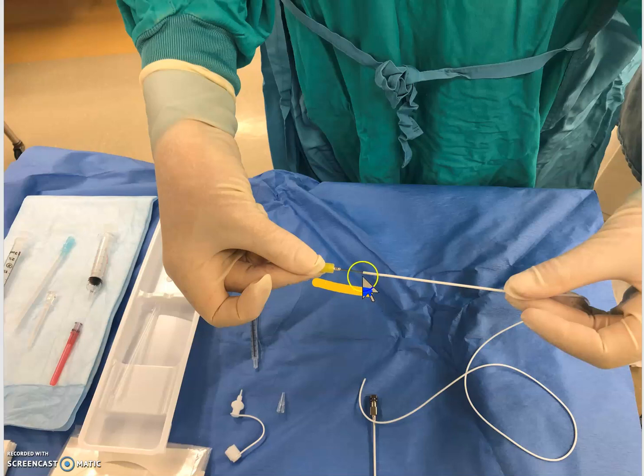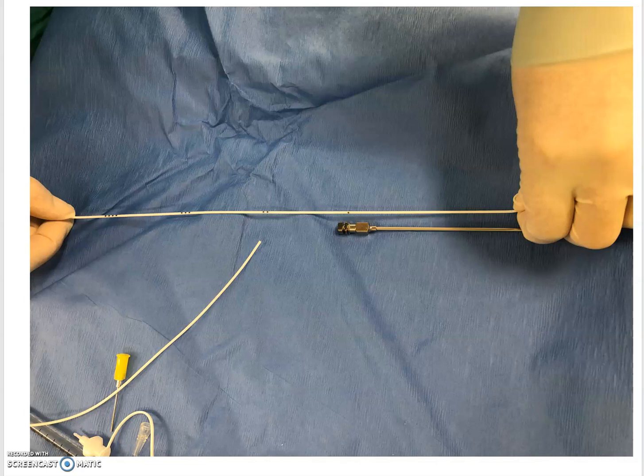The first thing you're going to do is attach that little metal piece to the catheter and flush it with some saline. Then orient yourself to the catheter markings — note that the markings are not what you'd expect if you're used to an epidural catheter. On the epidural catheter, the double marking is at 10cm.